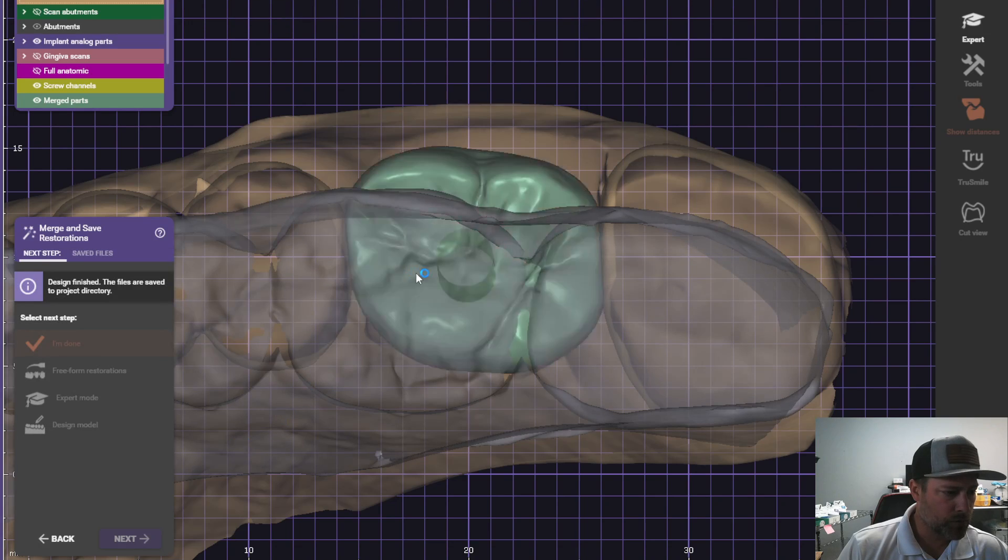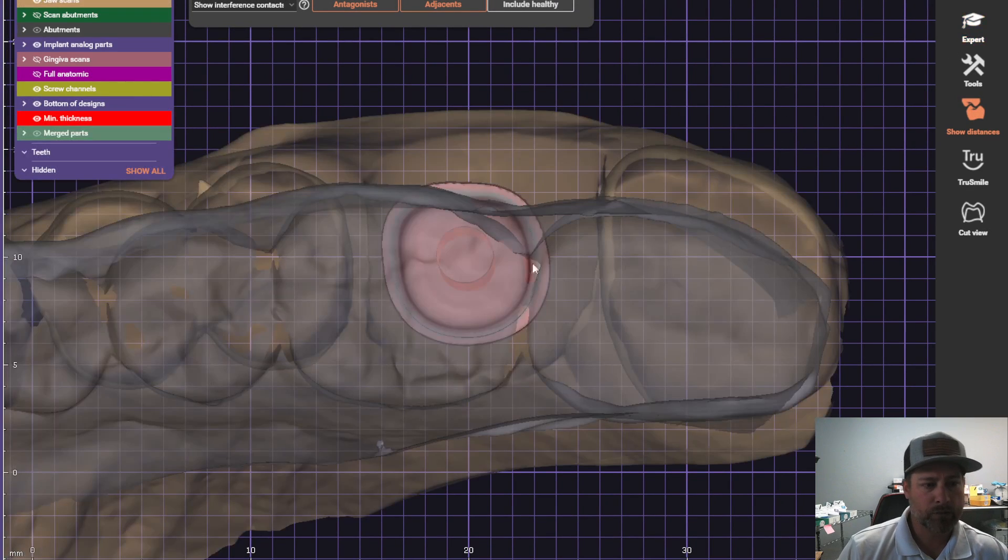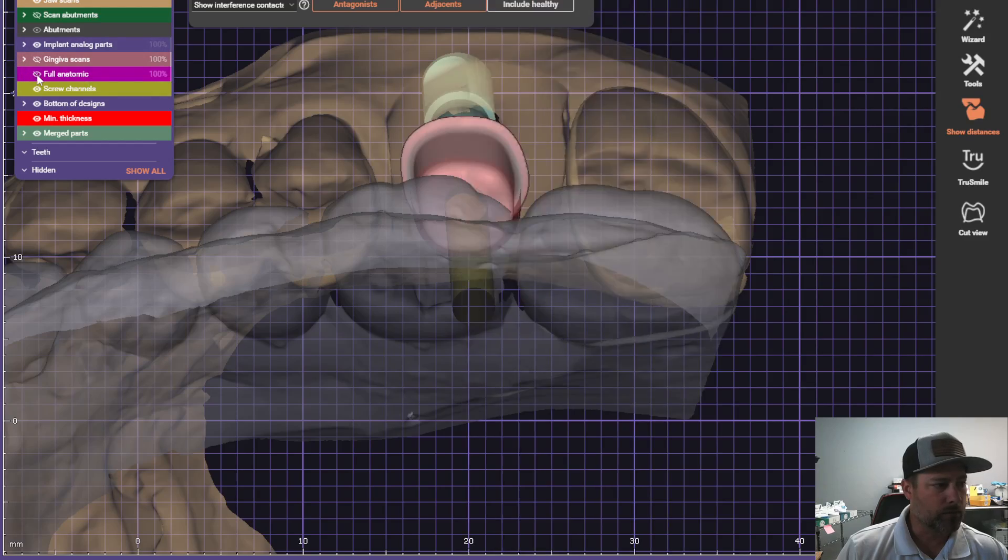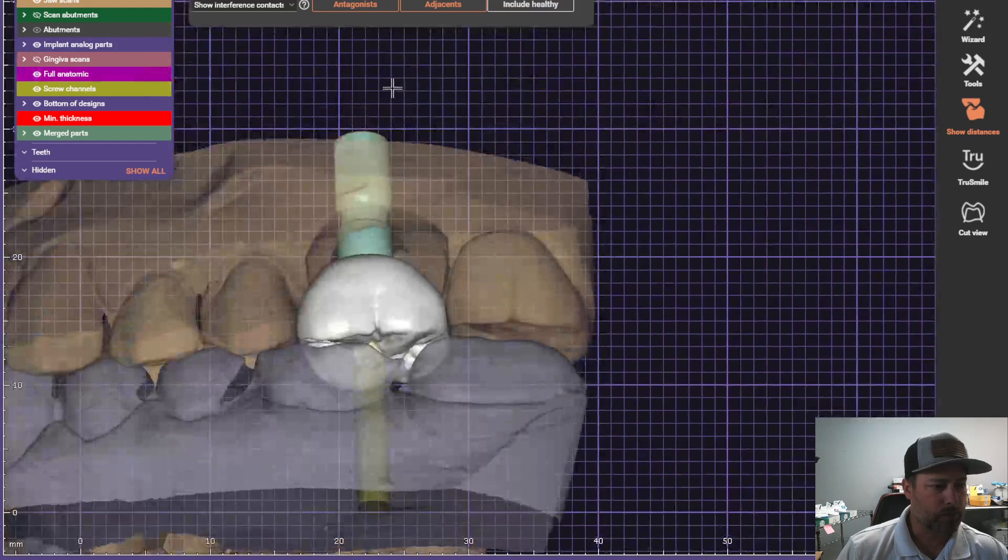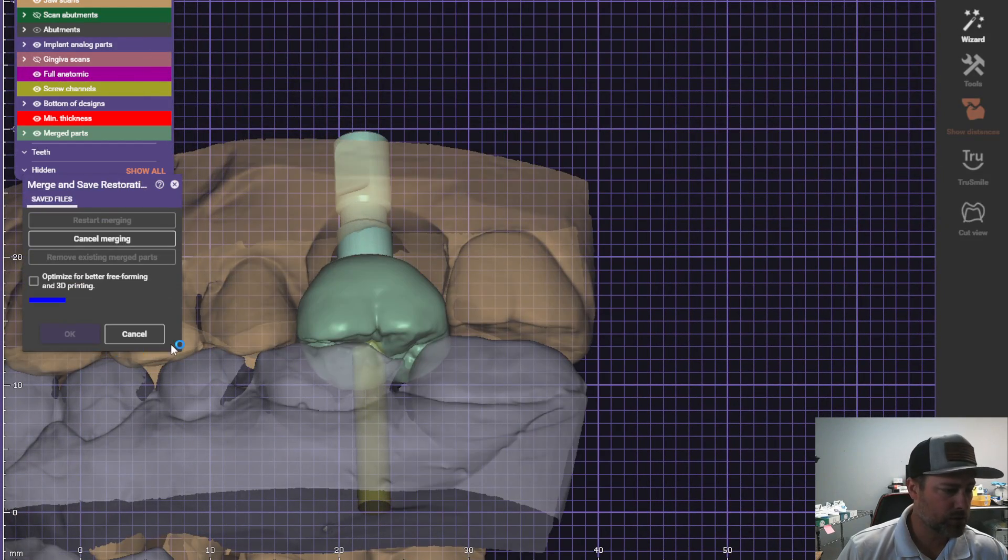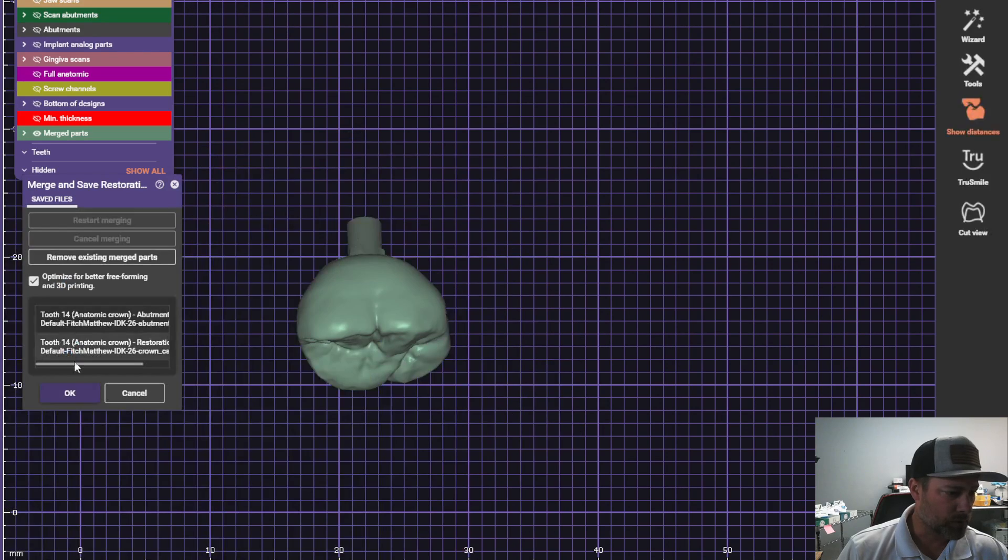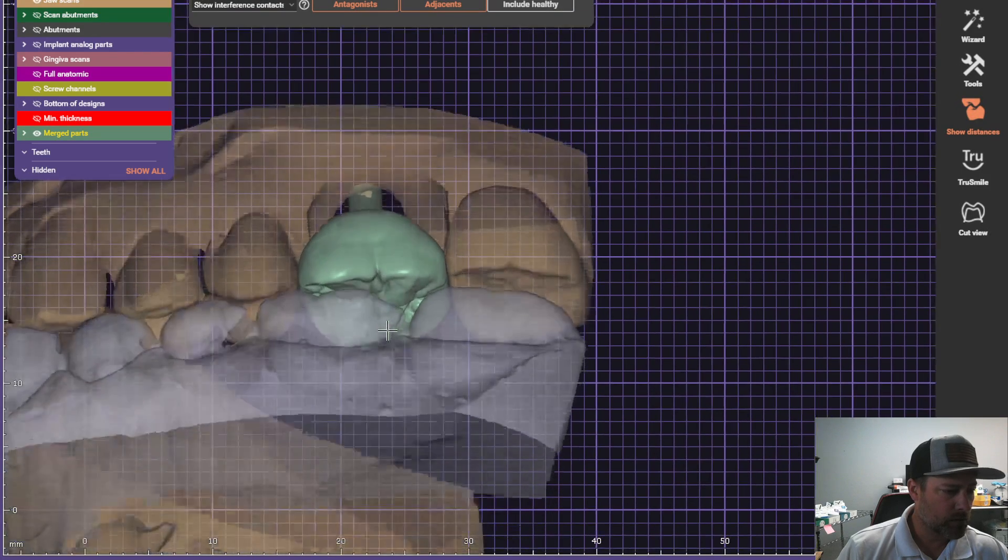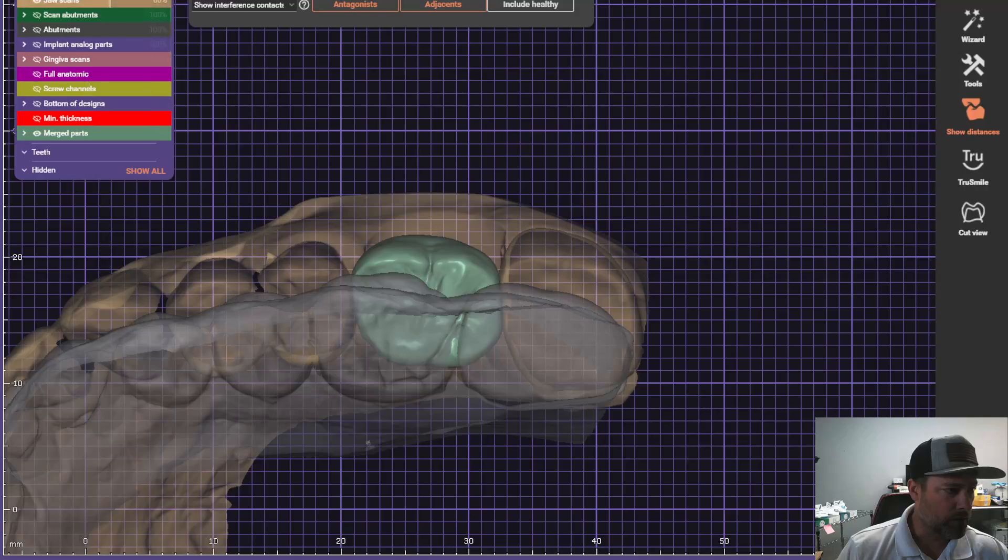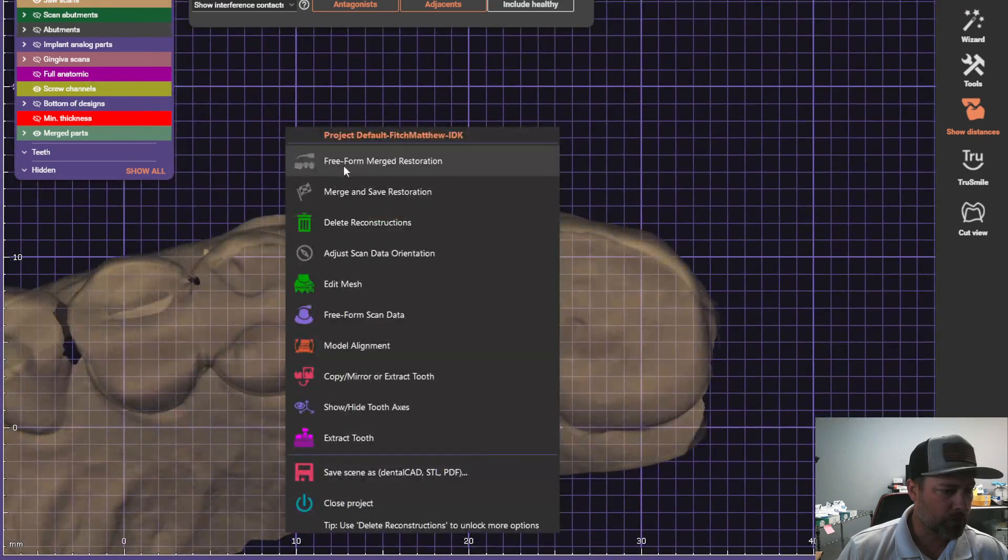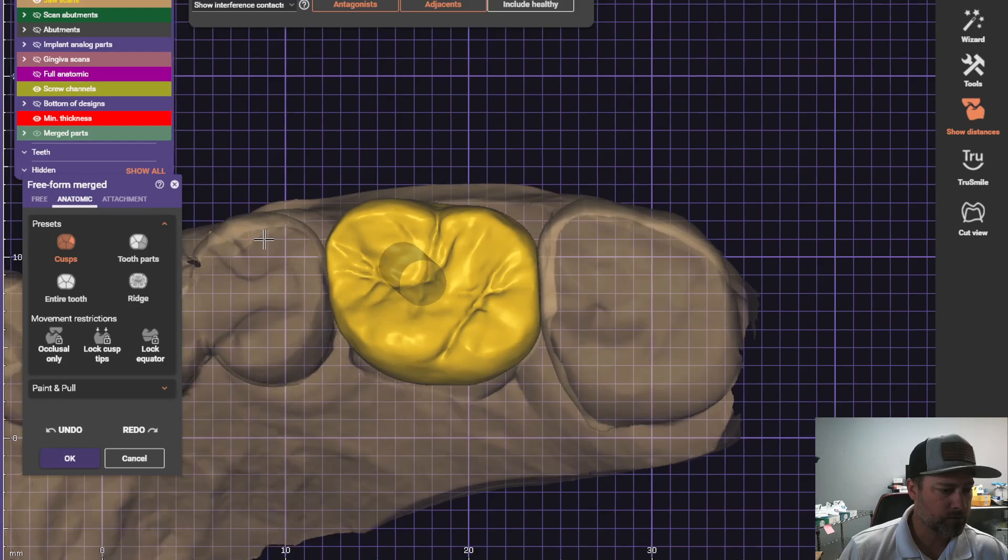The trick is you got to make sure you merge everything together. So go to expert mode. I'm going to merge the save restoration. I always optimize just to have it. And then we're going to turn on our screw hole. We're going to free form merge restoration.